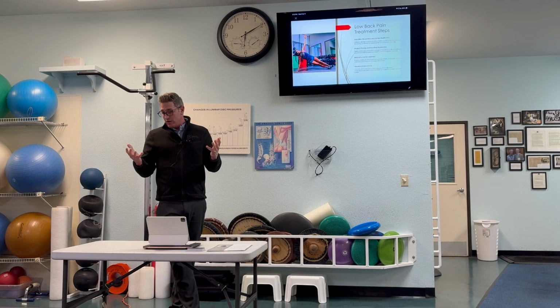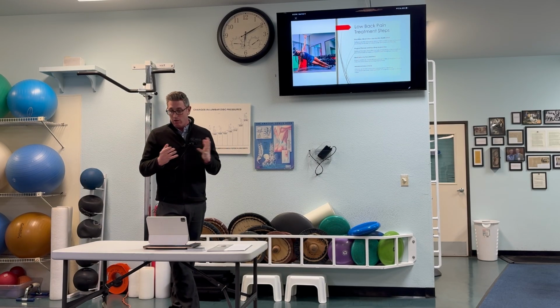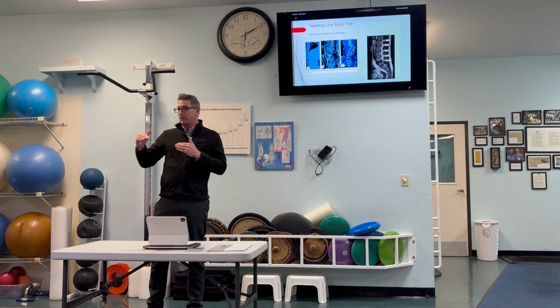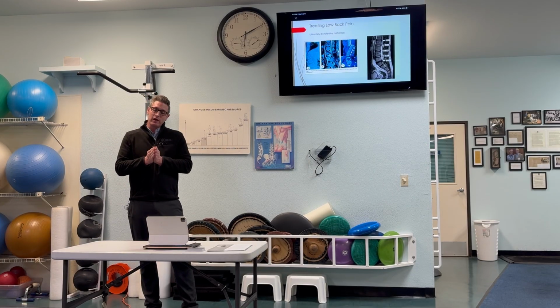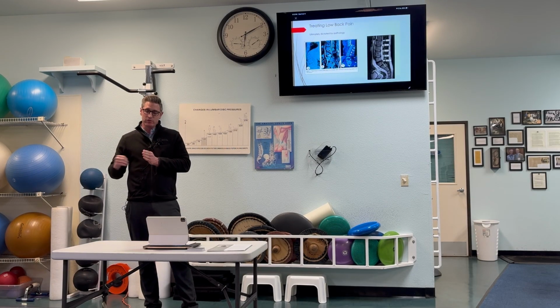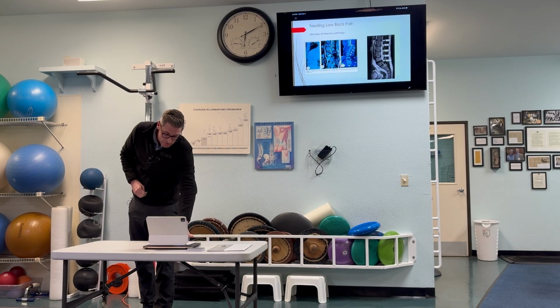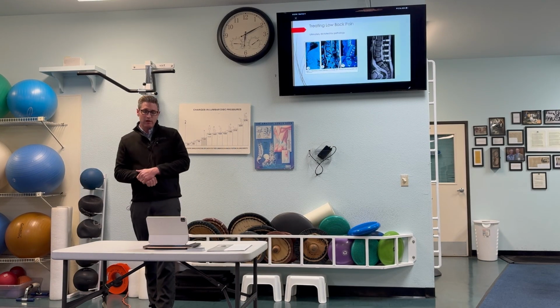Unfortunately, if that is not enough, then sometimes we have to consider surgical intervention, and that can be numerous in a variety of different modalities and techniques that can be used. However, with that said, there are some scenarios where we don't always go down that typical algorithm in which we feel that if we did that, then that could put us at higher risk for having further problems down the line. As we can see here, this is an MRI that demonstrates evidence of a relatively small disc herniation, but a disc herniation nonetheless at the bottom segment of that spine, L5-S1.